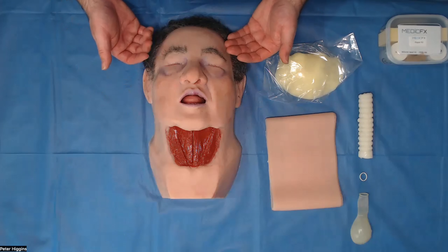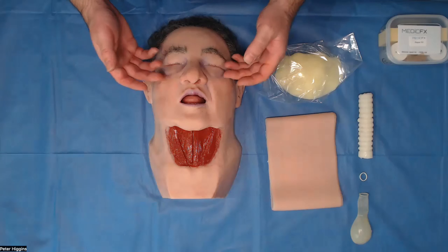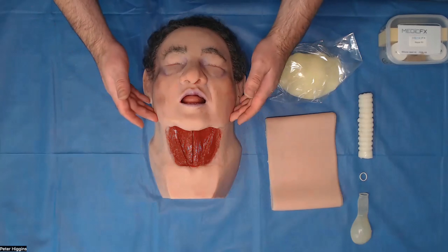As you can see on his features, he has discoloration in his lips, around his eyes and around his nose to indicate a lack of oxygen getting to him.